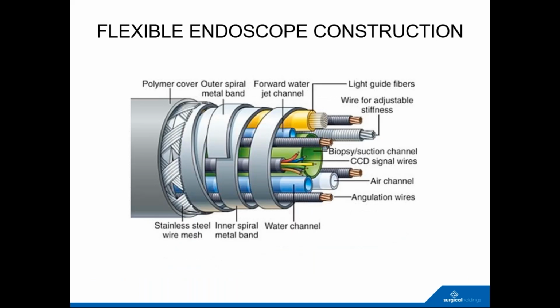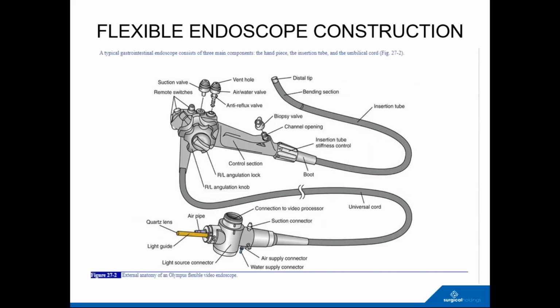Sorry, go on. Tony, I was just going to say, with the flexible scopes, where you've got the fiber optics for the light, is it exactly the same principle really? Because obviously that's very delicate in itself, isn't it? Yeah, with a rigid instrument, there's a separate light guide cable, whereas this obviously has it all integrated.